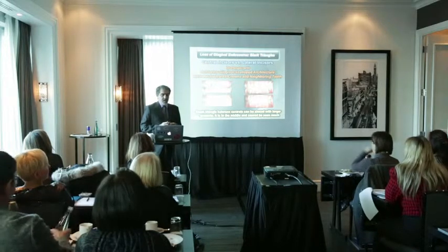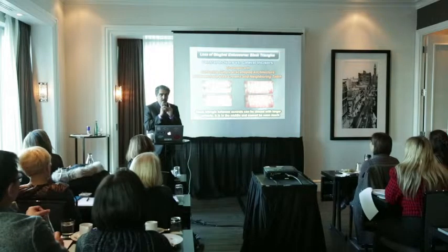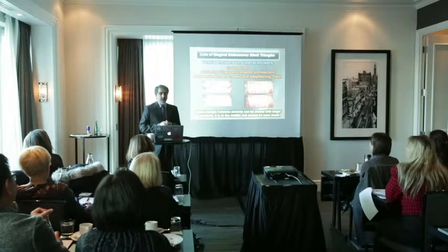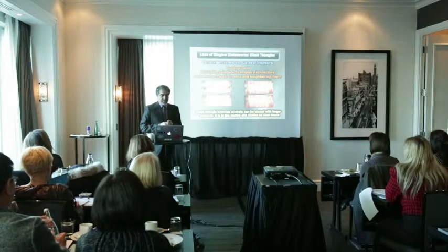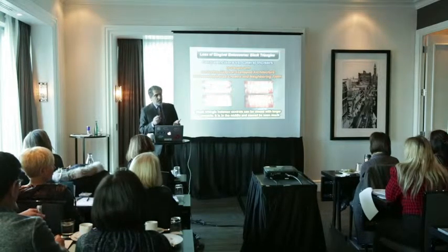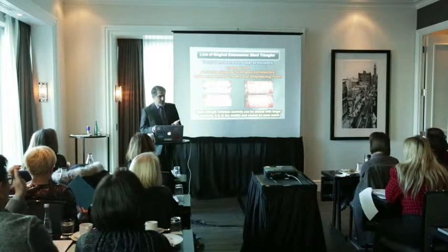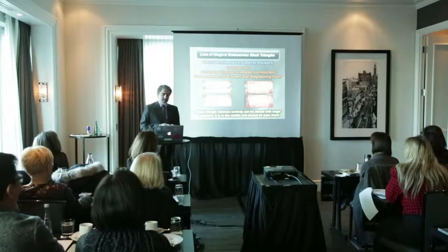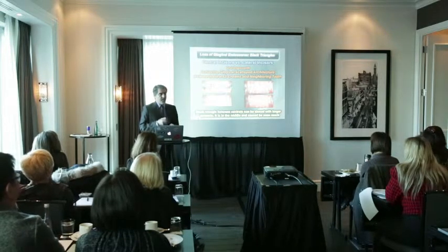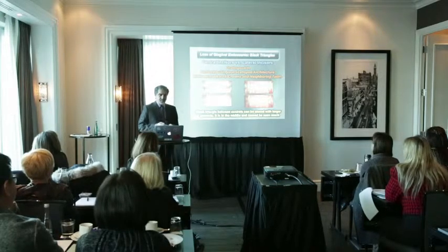At the same time, well, centrals are always right to the eyes of the people around them, and they can see that. So there's a difference between central incisors to be replaced versus the lateral incisors to be replaced, and you have to be mindful that, well, with the central you have a more difficult job.